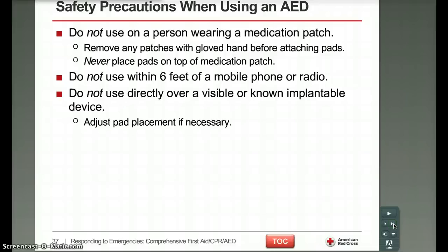Do not use within 6 feet of a mobile phone or radio. The reason why that is because of the electrical activity coming from your cell phone or radio. Once again, the AED is going to have a hard time analyzing the heart rhythm of the victim.